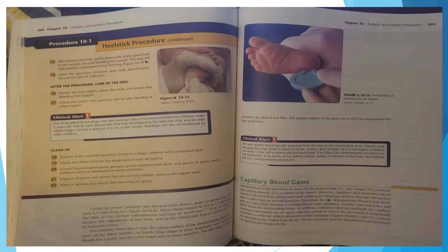Cleanup. Dispose of the used skin puncture device in a sharps container with a biohazard label. Check the infant's bed for any equipment or trash left behind. Discard blood-soaked gauze, sponges, grossly contaminated items, and gowns or gloves used in isolation rooms in biohazard waste containers. Dispose of gowns and gloves that are not from isolation rooms in regular trash. Wash or sanitize your hands after removing the gloves.